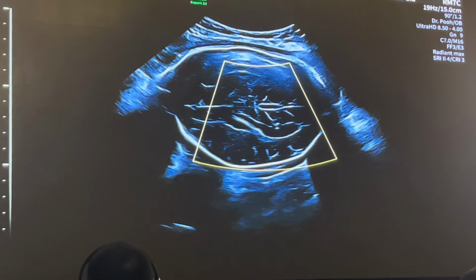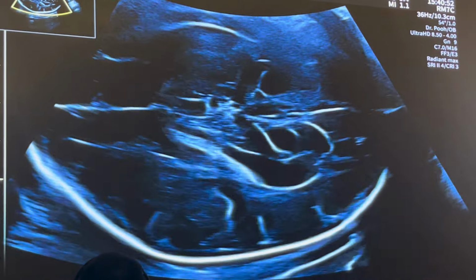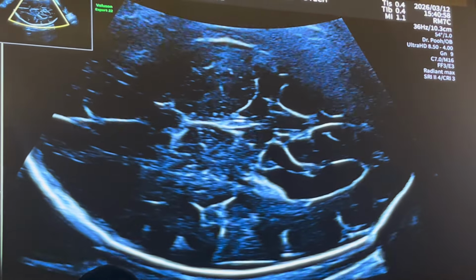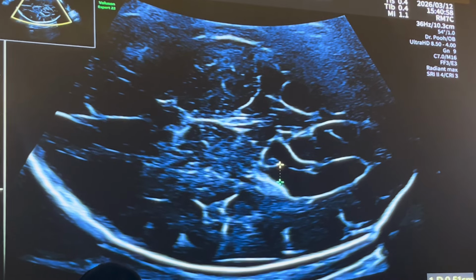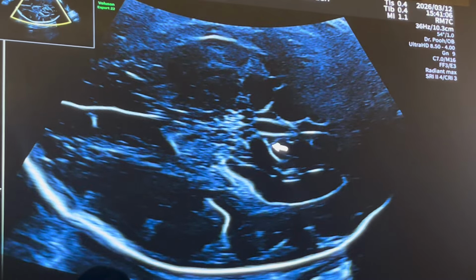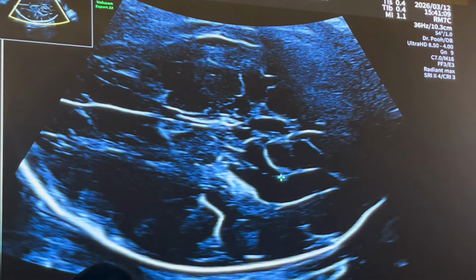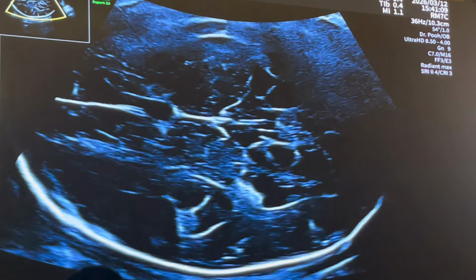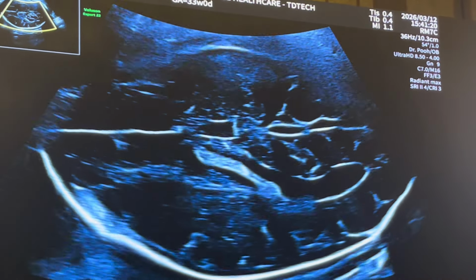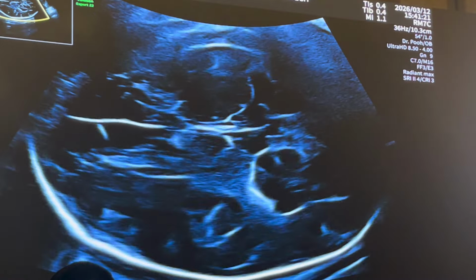And Suko, when you were doing a lateral ventricular measurement, do you do it according to the ISUOG guidelines, where you show the cavum septum pellucidum and you show the glomus of the choroid and then measure at this point? Or do you take the measurement of the lateral ventricles where you see the parietal occipital fissure, which is here, and it drops down to here? Do you measure the lateral ventricle at the tip of the parietal occipital fissure? I usually use the ISUOG guideline, the anterior complex, and looking at the choroid plexus of the lateral ventricle and the base of it. Yeah. Okay.